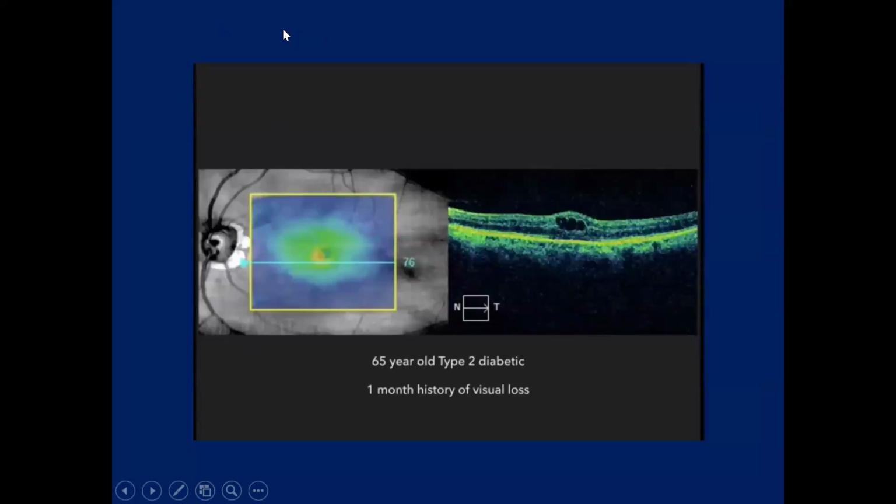No, Dr. Sadin? Anybody wants to comment on this? Yes, I can hear you. Anybody who comments on this? Macula? Did you have a laser treatment?